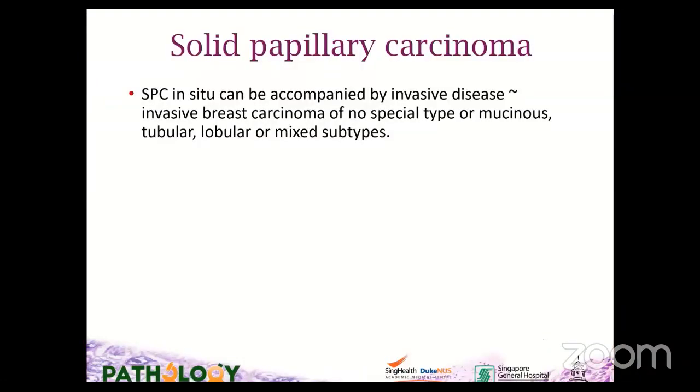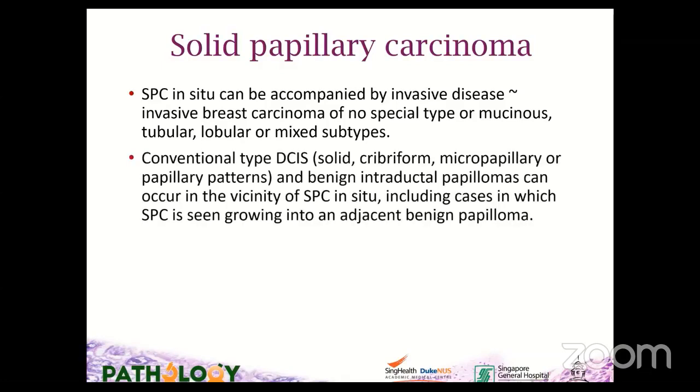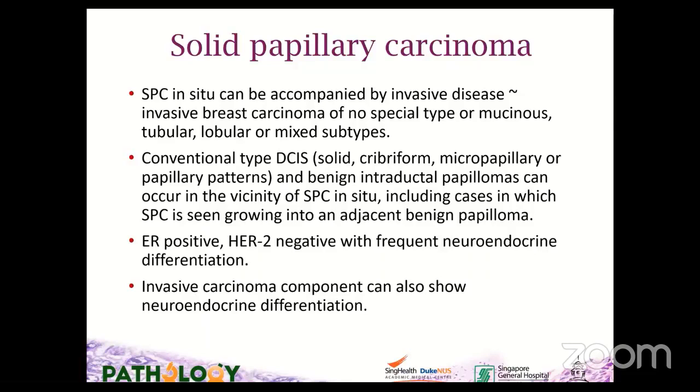Solid papillary carcinoma in situ can also be accompanied by invasive disease of no special type, mucinous, tubular, lobular, or even mixed subtypes. Conventional ductal carcinoma in situ and benign intraductal papillomas can be seen in the vicinity of solid papillary carcinoma in situ, including cases in which the solid papillary carcinoma is observed growing into an adjacent benign papilloma.